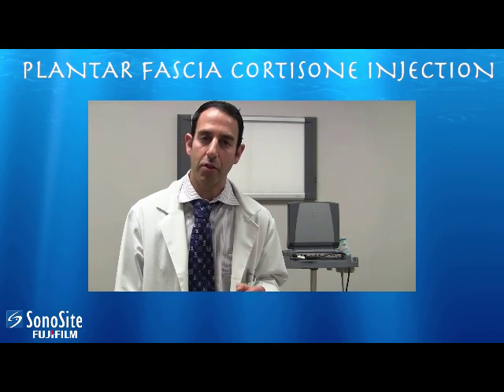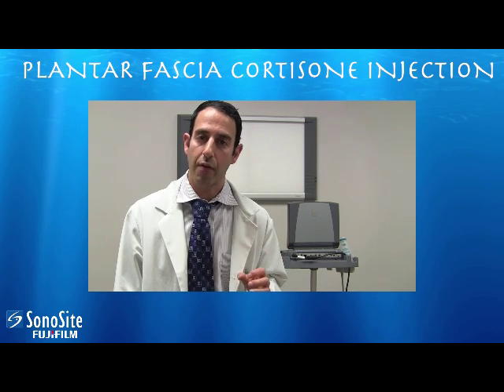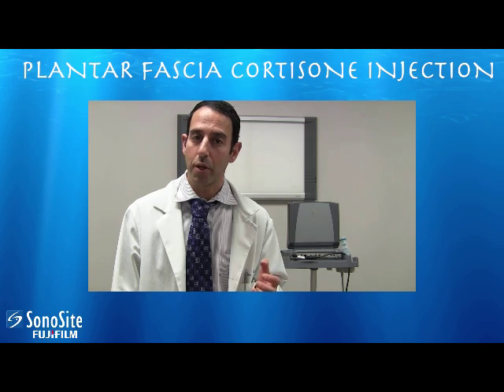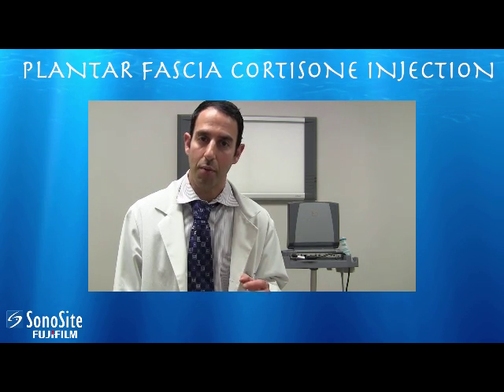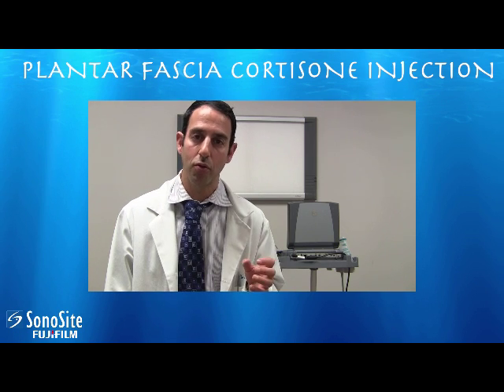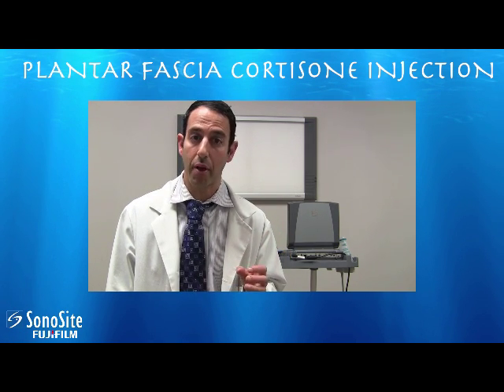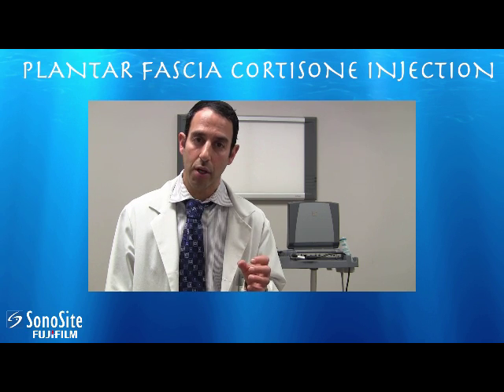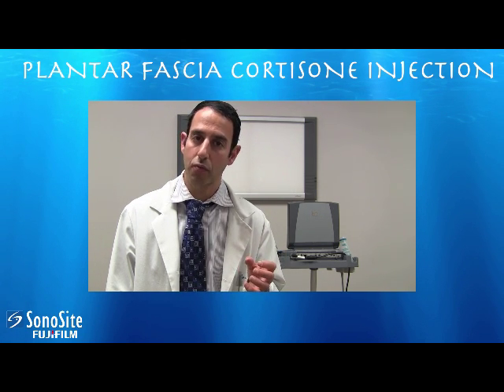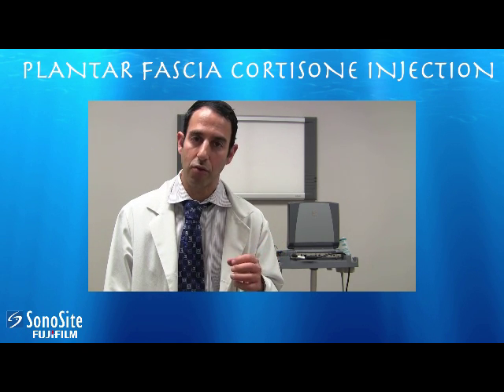This is a 42-year-old female presenting with pain in the right foot for about four months, diagnosed with plantar fasciitis. A cortisone injection helped her for several weeks but then the pain started coming back. Ultrasound was useful diagnostically — I was able to see thickening and heterogeneity of the plantar fascia near the origin at the medial process of the calcaneal tuberosity, and also an intrasubstance tear of the plantar fascia.